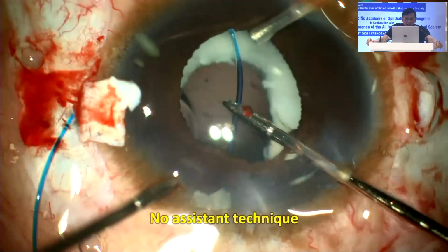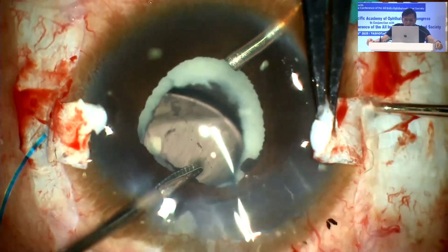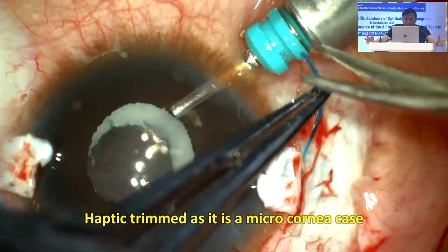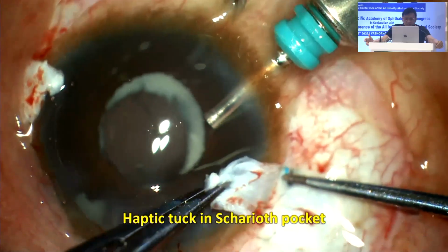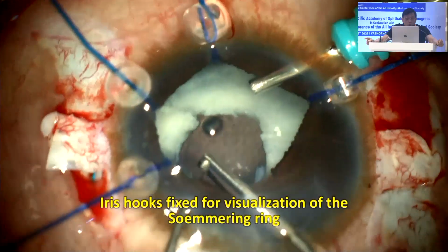You see that? Once I do the handshake technique, I transfer the haptic from one hand to the other, catch the tip of the haptic, and externalize. Now remember, it's a microcornea, 7-8 millimeters, and 6 millimeters is occupied. Cut the haptic, because obviously a lot of haptic is externalized. Tuck it inside in the Scharioth pocket. So far, so good. Now remember, now you have to work on the Soemmering ring.